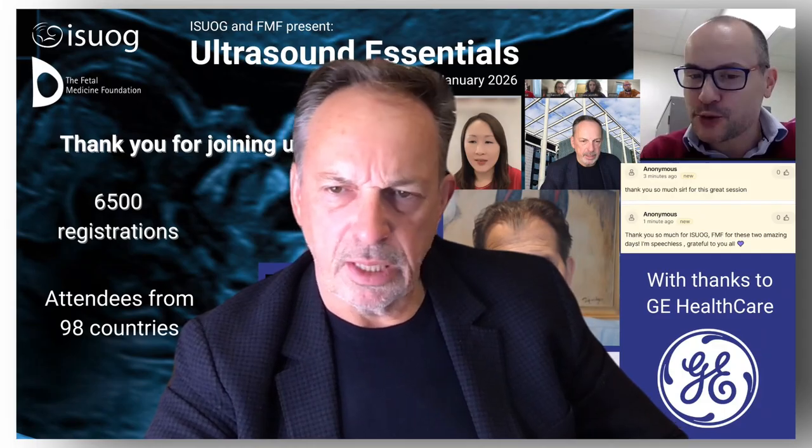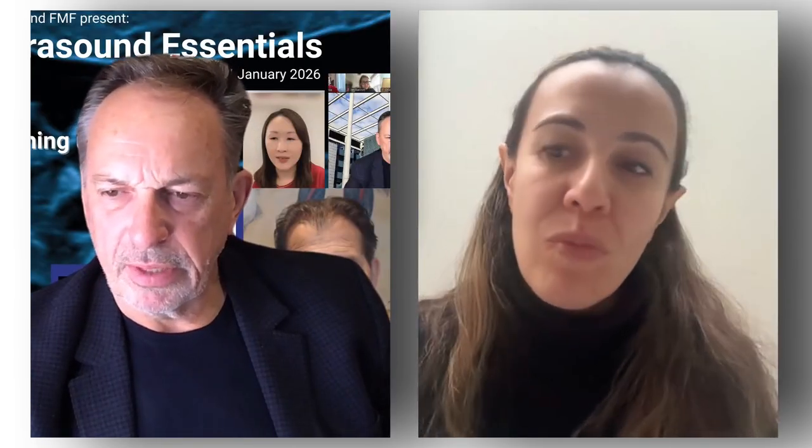I think the other big issue, and I don't know what Mayor's view is, since you're there co-chairing, is differentiating between cancer and TB, which are difficult. One thing I think is the fluid or the ascites. With TB, it tends to be a bit more particulate, and you tend to have septations in it and things like that, whereas it tends to be more anechoic or low level.